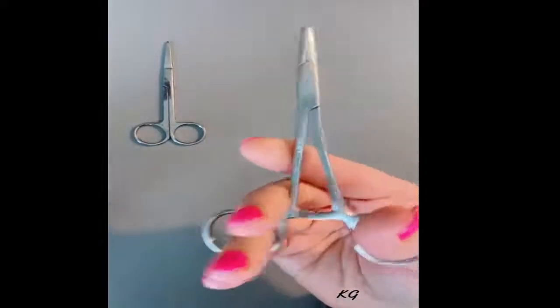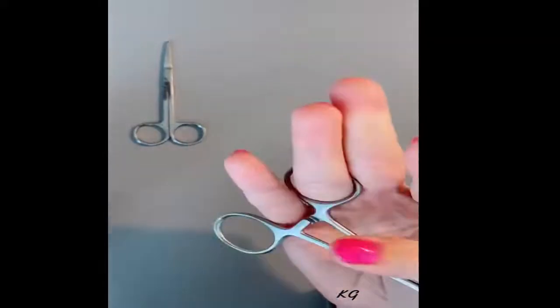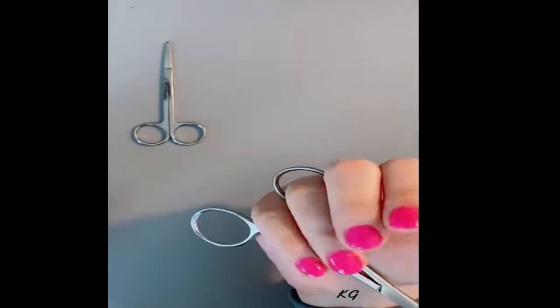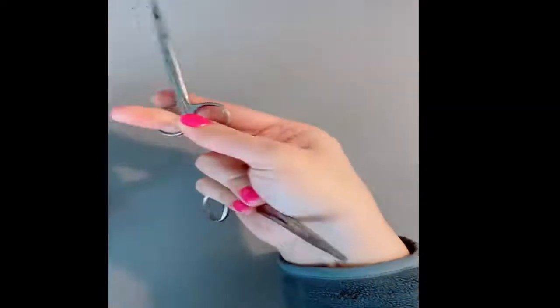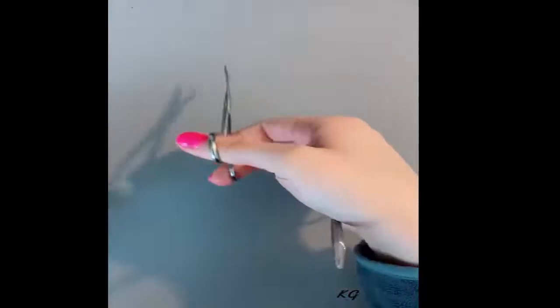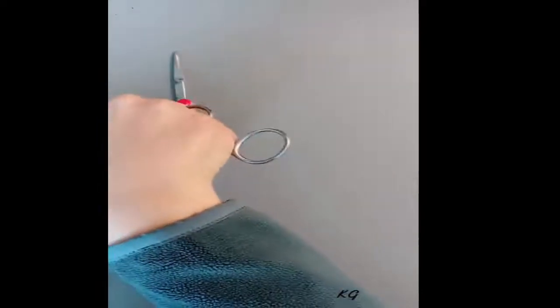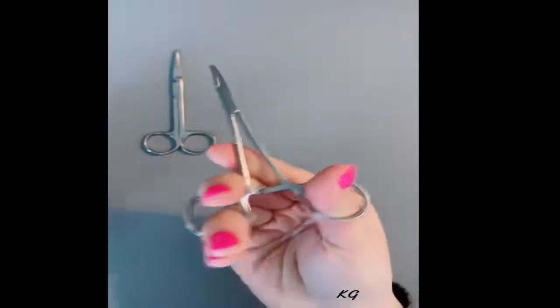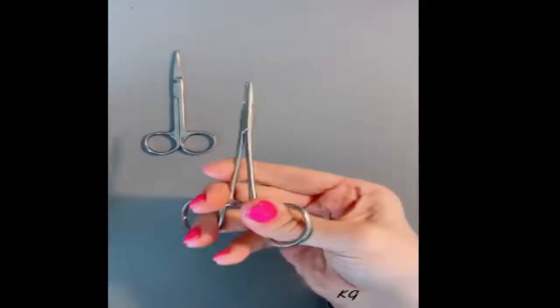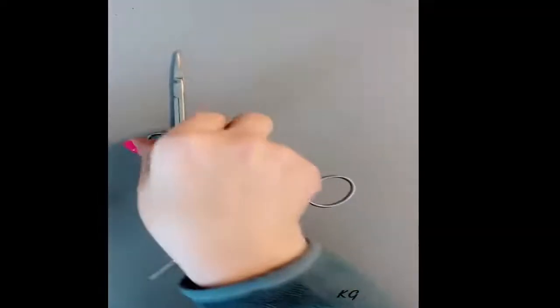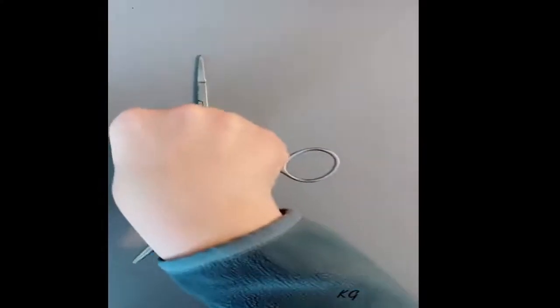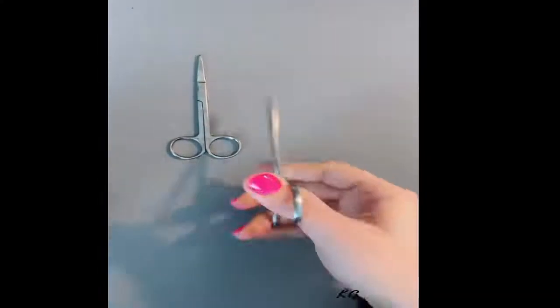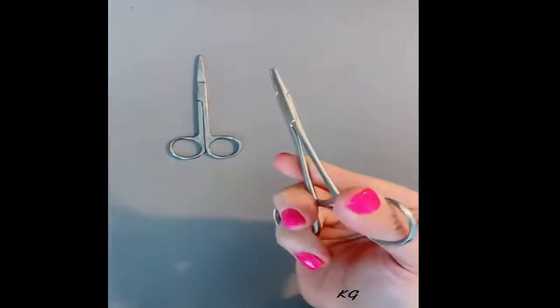Another cool technique is keeping that needle driver around your fourth finger, flip it around so you can pick up the scissors in case there's nobody assisting you in surgery. It saves time instead of putting one down and picking one up. Let's see that again. Loop it around our fourth finger, pick up the scissors, cut our stitch, put it down, and then back to suturing. There you go folks, that's how you do it.